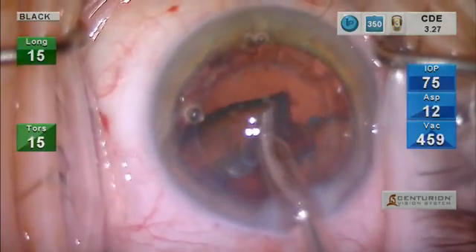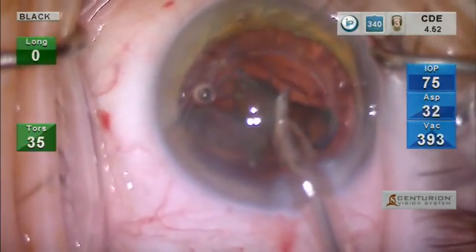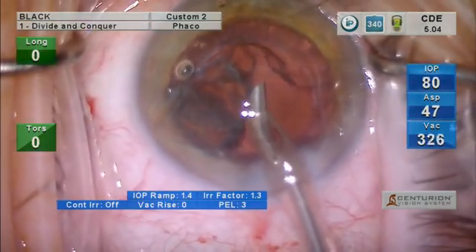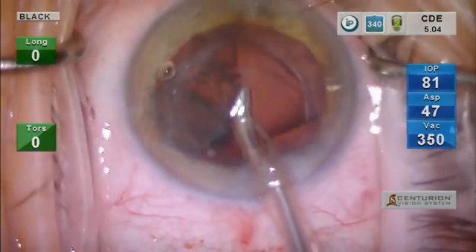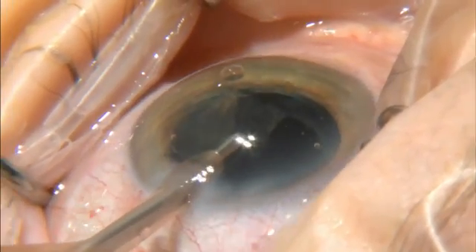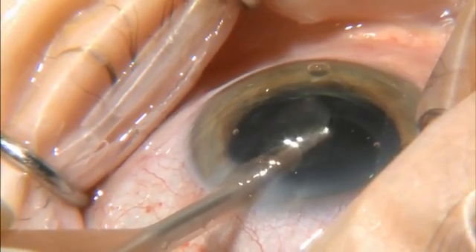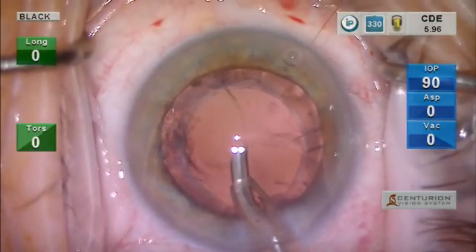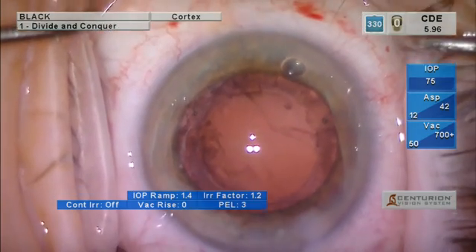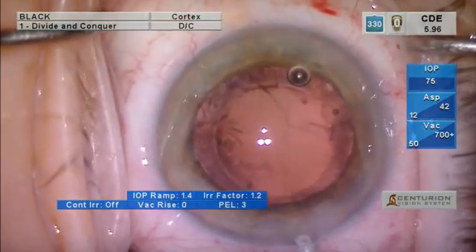The Centurion FACO machine has tremendous fluidics. We are using the balanced tip, which is a double curve, as you can see here, which greatly improves the efficiency of the FACO emulsification due to a greater excursion of the tip. We then want to make sure we remove all remaining fragments from the angle and behind the iris. This is a rather large fragment — notice how incredibly stable the anterior chamber is. We set our intraocular pressure at 75 throughout the procedure, which we find leads to a very deep and stable chamber.